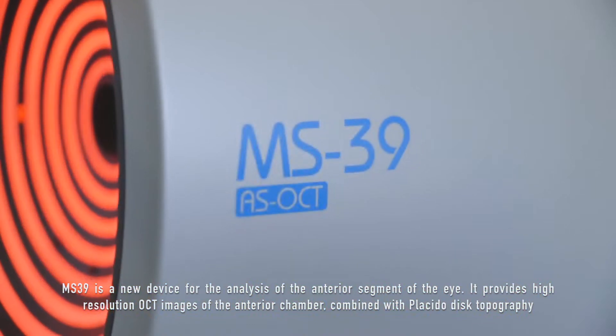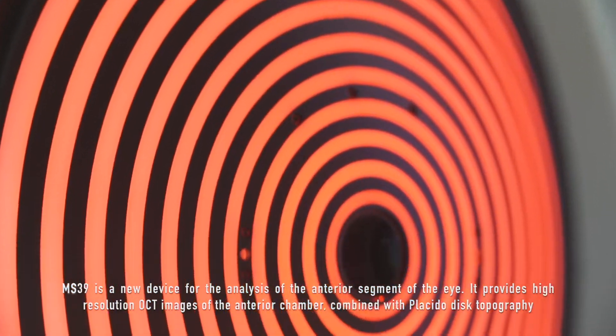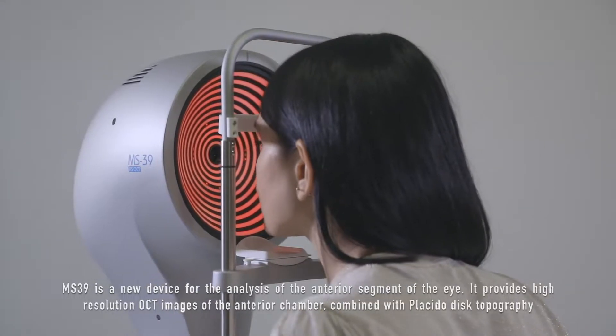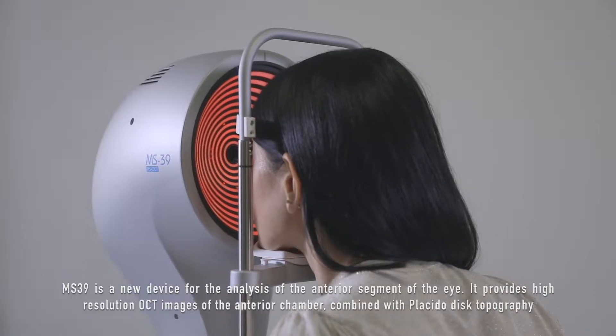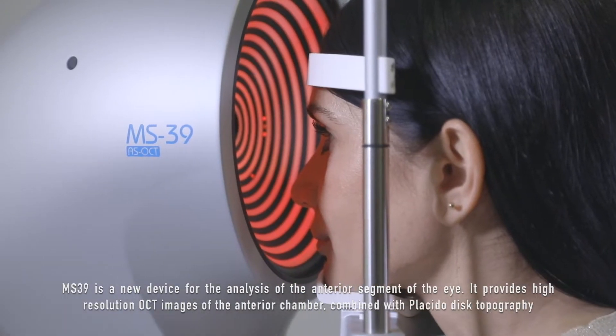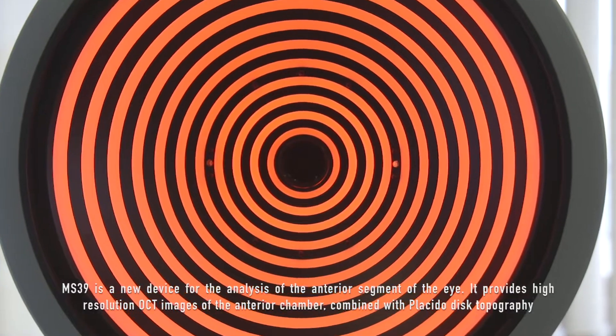MS-39 is a new device for the analysis of the anterior segment of the eye. It provides high-resolution OCT images of the anterior chamber combined with Placido disk topography.